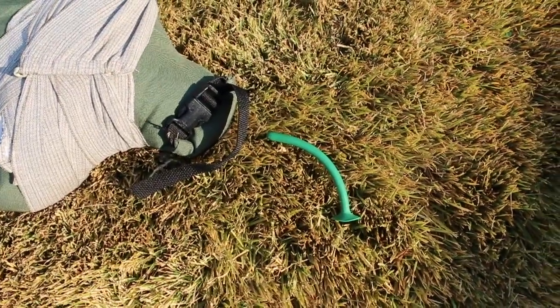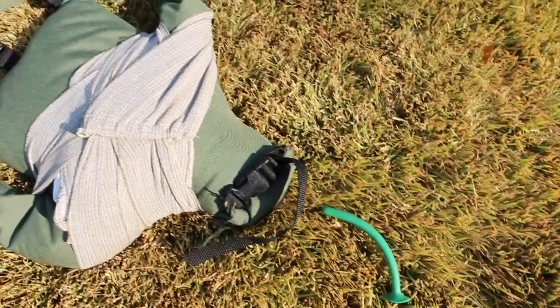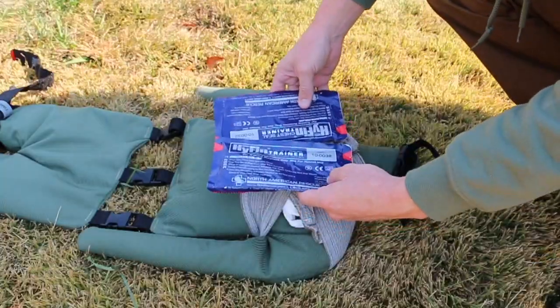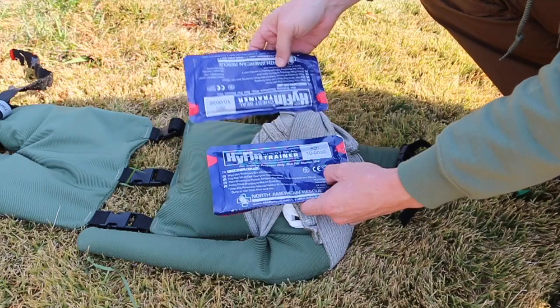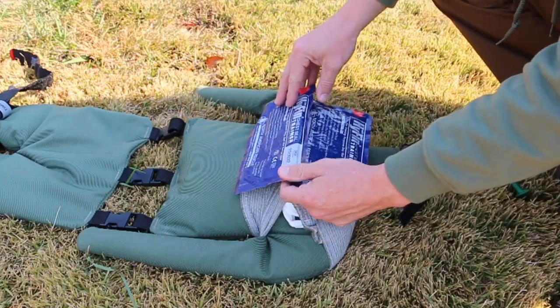All right, so we're going to use our imagination here, kids, and I've got the NPA placed inside our patient. He's not doing so well, but we're going to take good care of him. All right, so the next part of this, we've got M, we've got A taken care of. So now we're on to R, which is respiratory. So we're going to use the Hyfin chest seals in this example here. These are the vented chest seals.